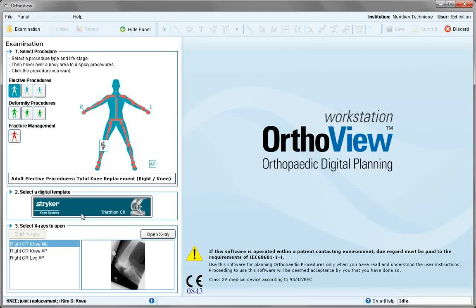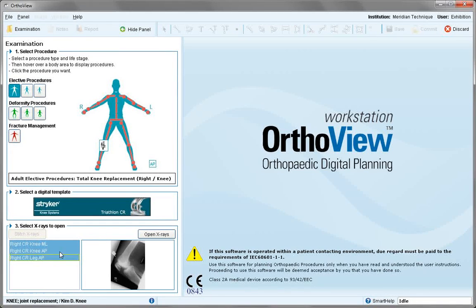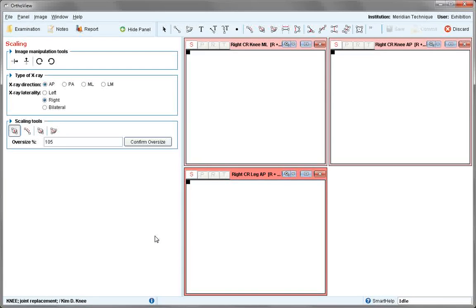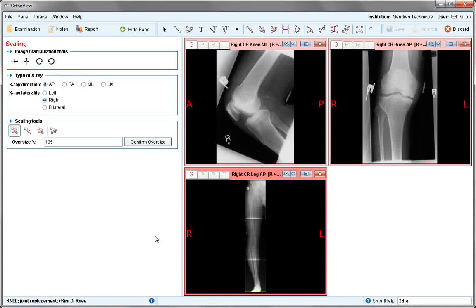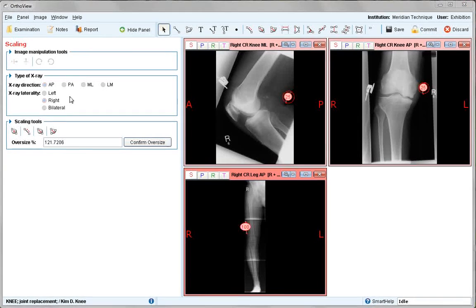The favourite template appears. Select all images available — both knee joint and long leg and open x-rays. Now in the scaling screen, all images need to be scaled individually.